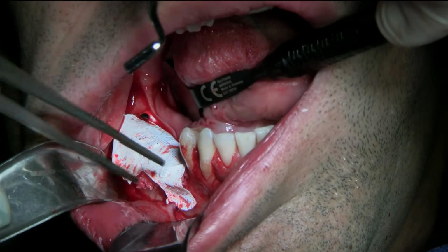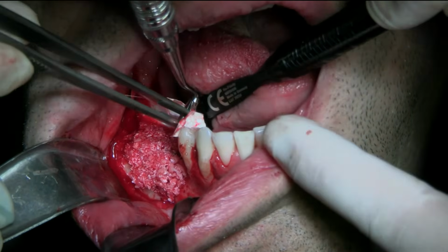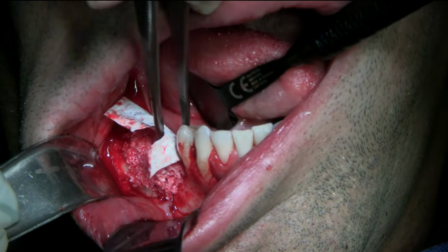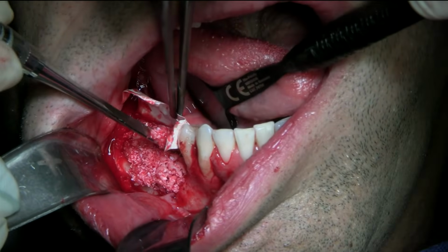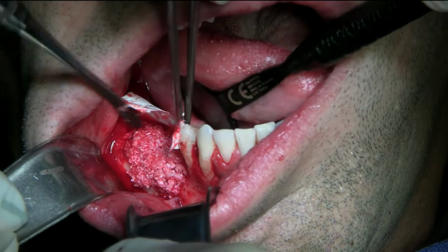The width, so let's see what happens when I open it. See, it looks already almost like we regenerated it. That's the beauty of this combo of autogenous and the xenograft, because with the blood, it's very much sticky.